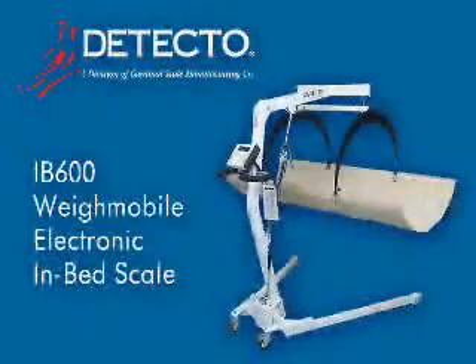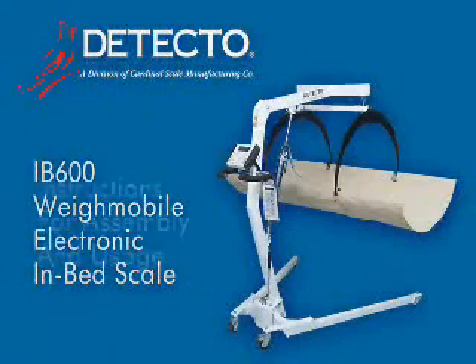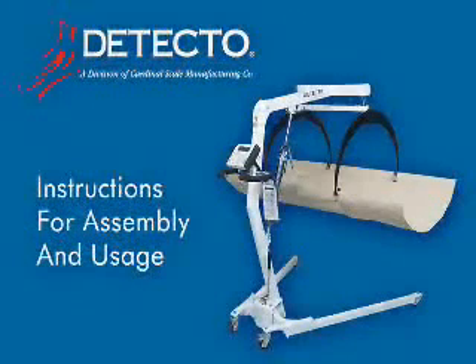Congratulations on your selection of Detecto's model IB600 weigh mobile electronic in-bed scale for weighing bed-bound, frail, or intensive care patients. The IB600 weighs patients up to 600 pounds and should be unpacked and assembled by a skilled maintenance person in a spacious area of the clinical facility, such as the receiving or maintenance department.